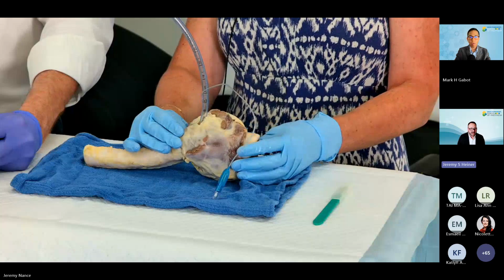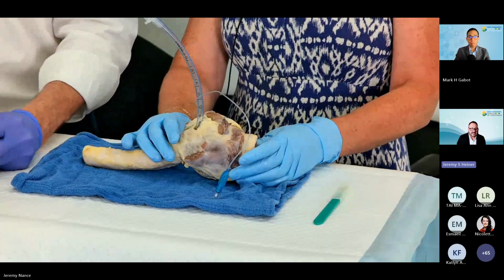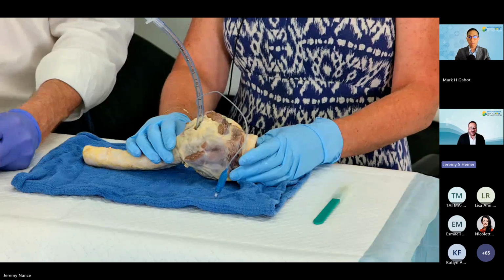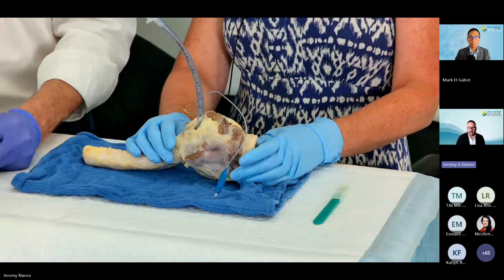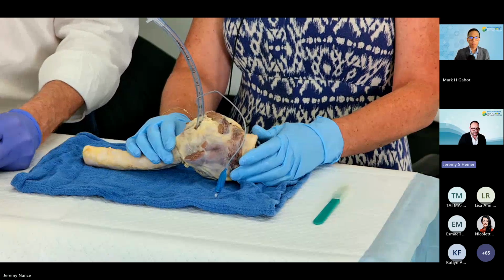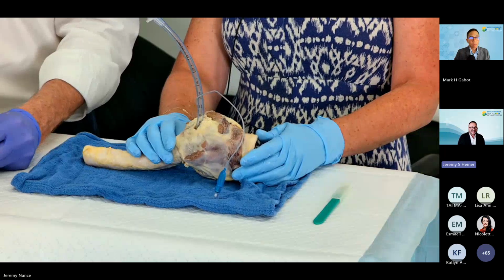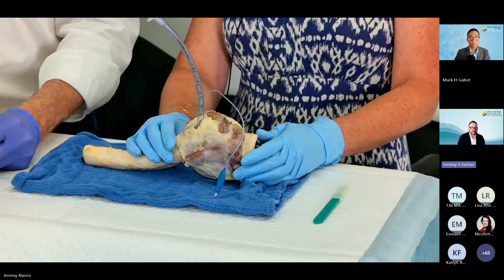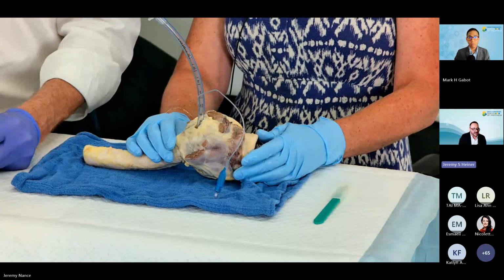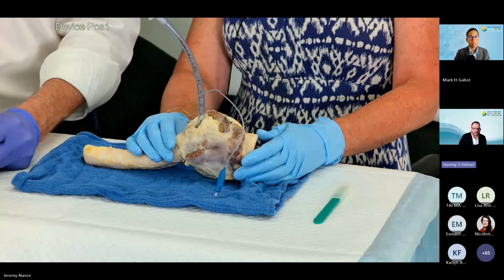And the number one cause of failure in the surgical technique is not puncturing through all the layers of tissue and having a false passage of the tube into a pretracheal layer of tissue where we just are ventilating in that and causing essentially subcutaneous emphysema. We're not in the trachea. So it does require some attention, and the membrane is a bit thicker when you're using the surgical technique on actual tissue.